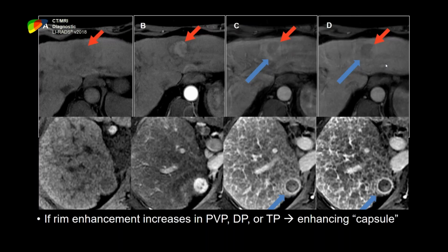If you are using subtraction, then you know whether it's enhancing or not. So in future editions of LI-RADS, you may want to address this categorically, either develop some criteria or say that arterial phase enhancement and washout are independent criteria, and you just need to apply them independently. So Claude?